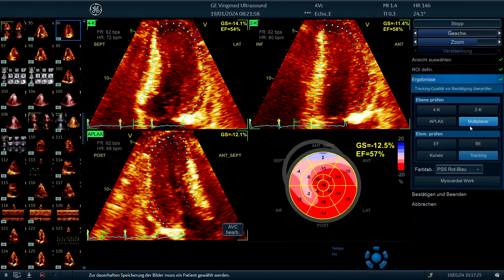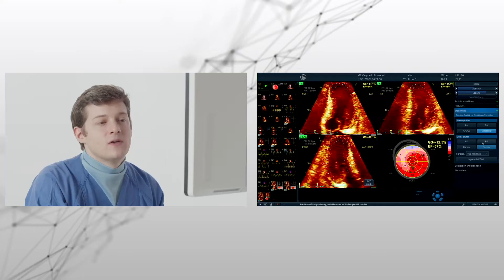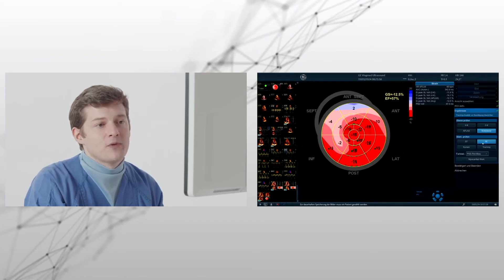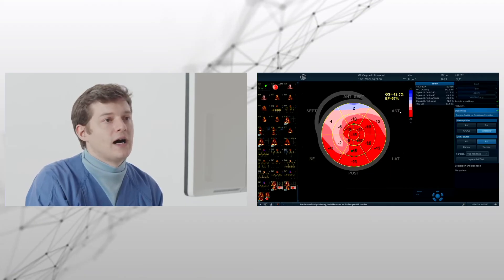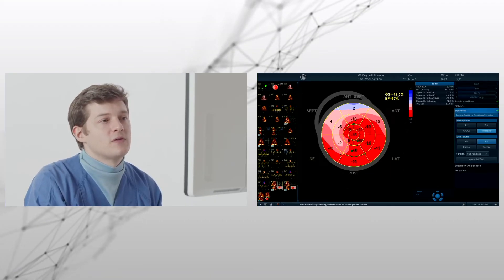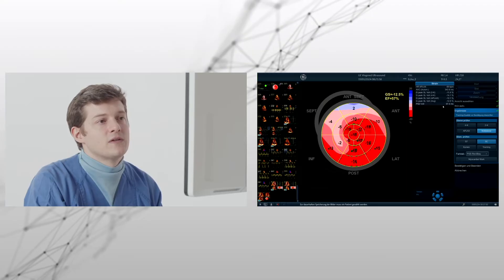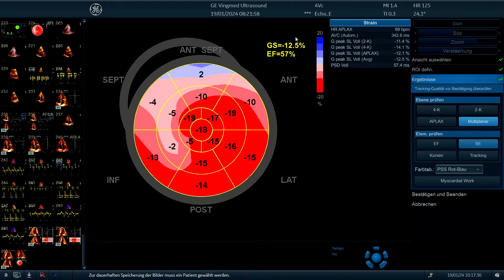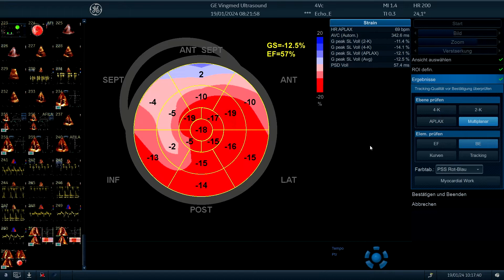Now we continue with the bull's eye exam, the bull's eye where we see several time intervals. Here it's even better than we measured before. It is around 60 milliseconds. The strain is in the range of minus 12.5, minus 13. That is something I believe.